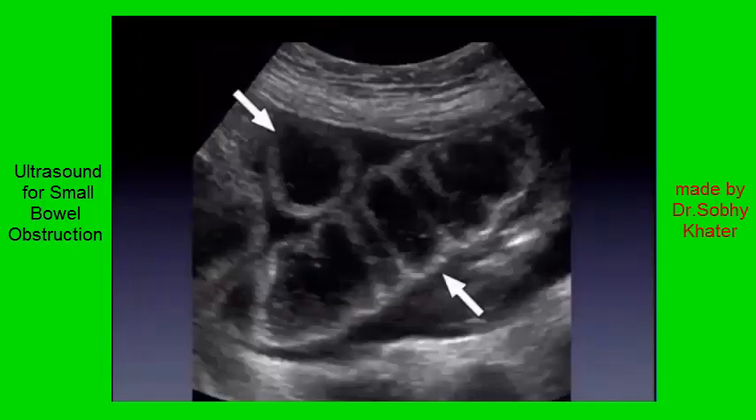As a parting shot — now, what do you see? I think you can make out this distended loop, obviously thickening of the wall, and you definitely see that fluid. I think now you can see this is obviously a small bowel obstruction.